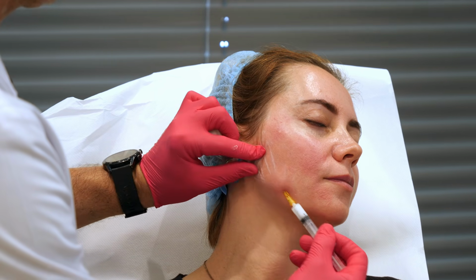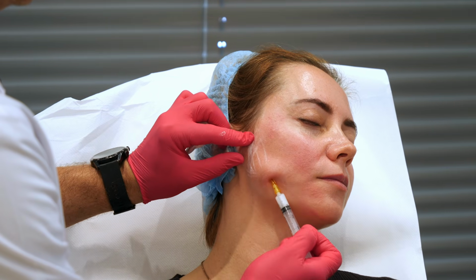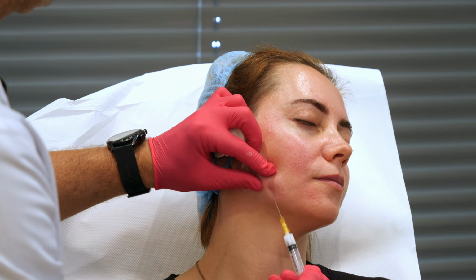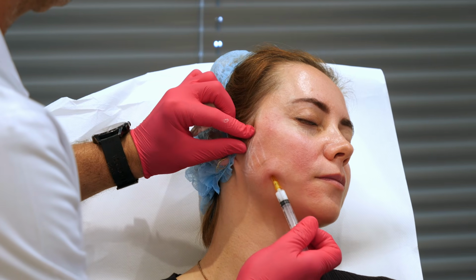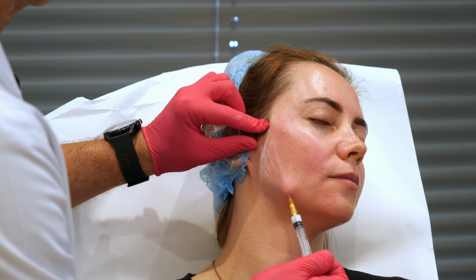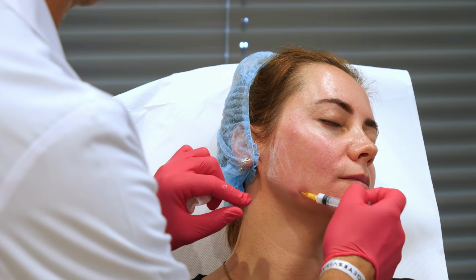To give more lift effect, I work at the posterior pillar. Deeper. And just now in a more superficial plane.